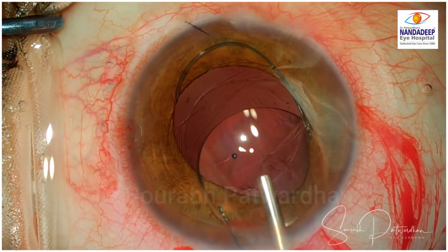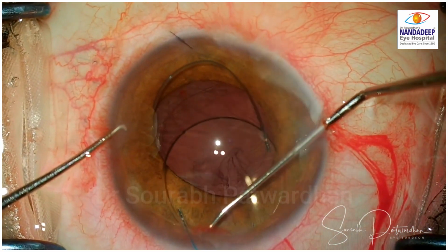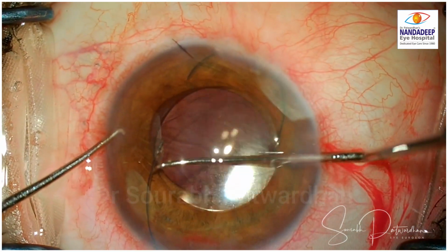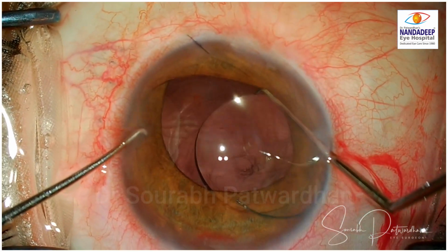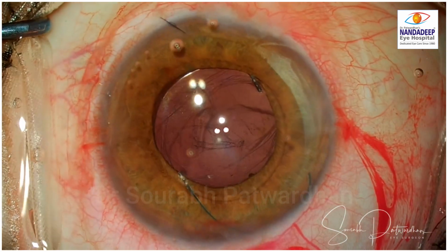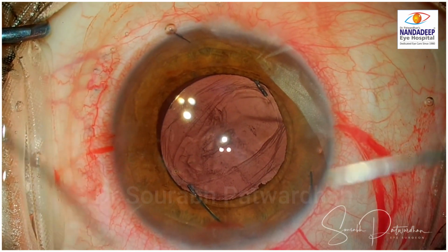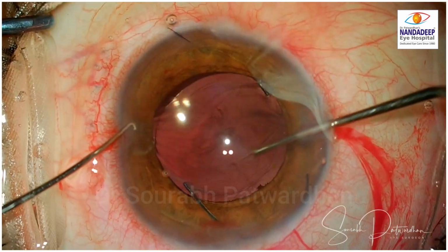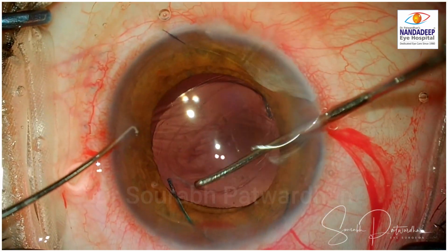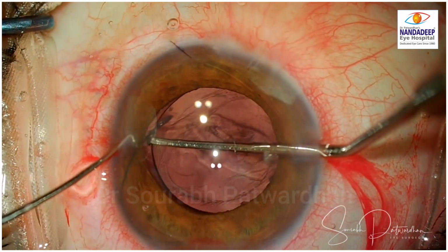So first let it open in the anterior chamber and then you carefully rotate the haptics into the sulcus. Just watch how the haptic goes into the sulcus, touching the pupillary margin. That's very important. There should not be any gap between the pupillary margin and the haptic when you are rotating it into the sulcus. Otherwise, again, it might just go into the bag and may drop into the vitreous.